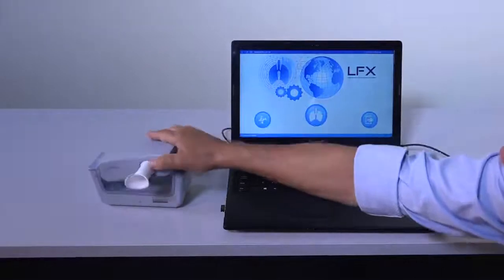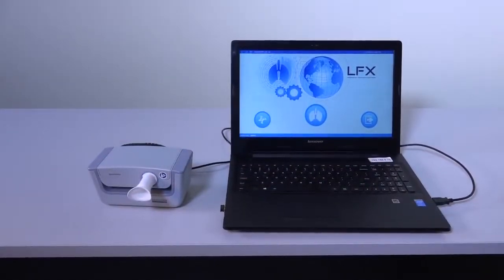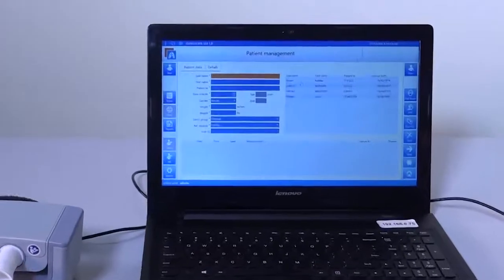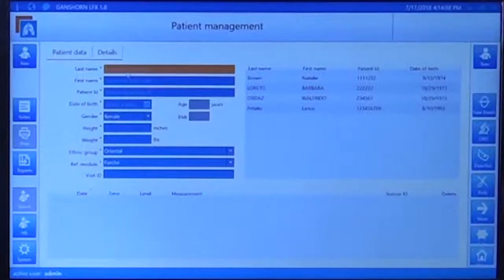The Spiroscout is PC based and it uses the LFX program. The LFX program is one of the most user-friendly programs that we can have in spirometry. When you come into the workload, start work, the lungs in the middle, just click on it and it will immediately open your database in which you will have all the patients that you have already tested, or if you need to do a new patient, just put the new data of the patient here.